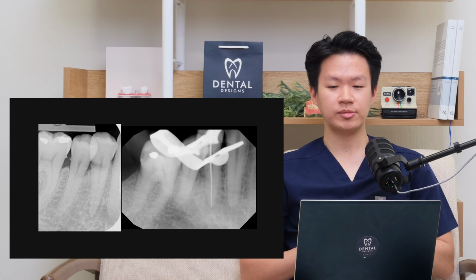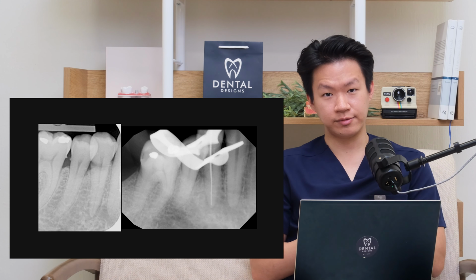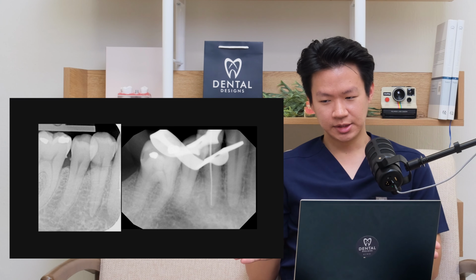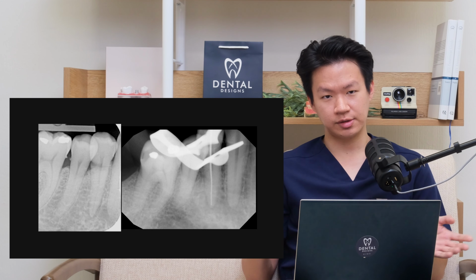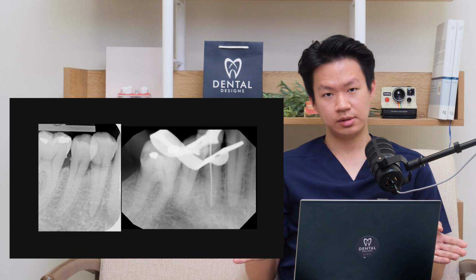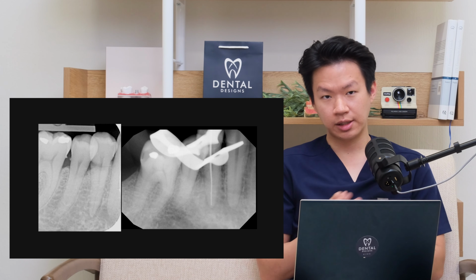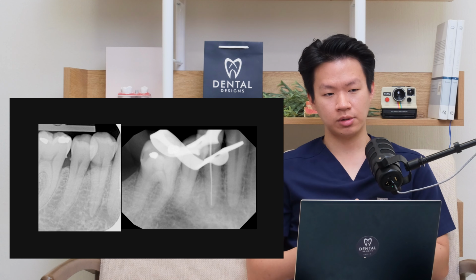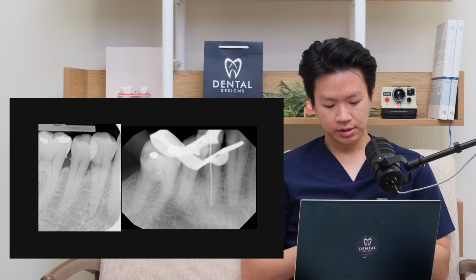Imagine a pipe where, along the pipe itself, there's a divergence, so it splits into two separate pathways. This is especially important for root canals, because if the canal splits into two, we want to make sure that we detect and adequately clean the separate split so that we can achieve a more thorough disinfection of the root canal system.